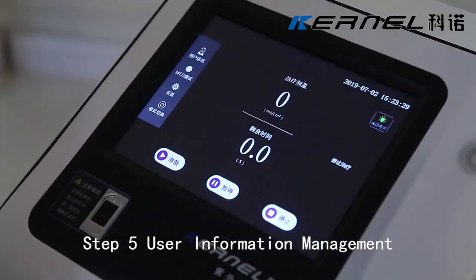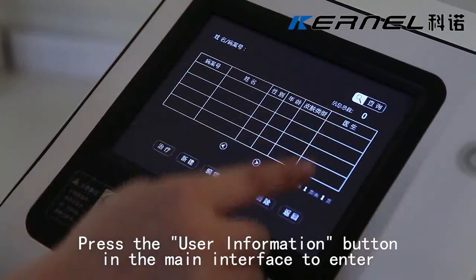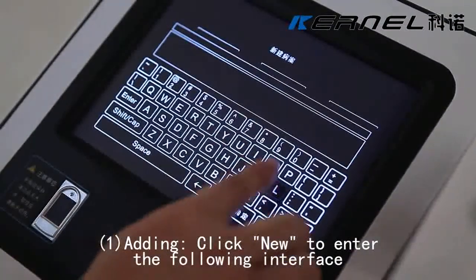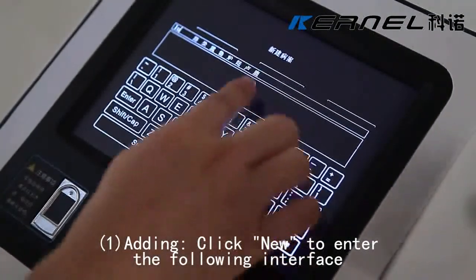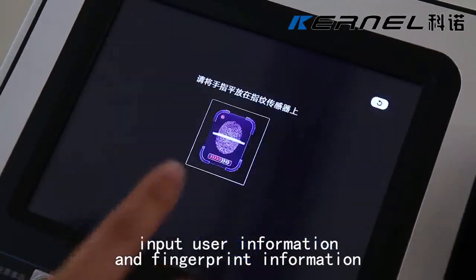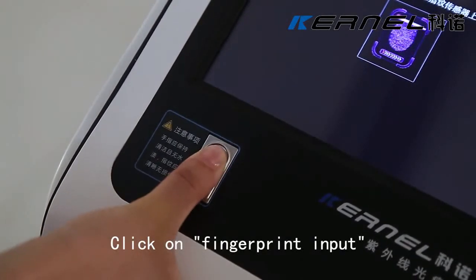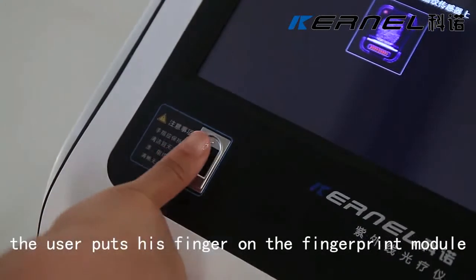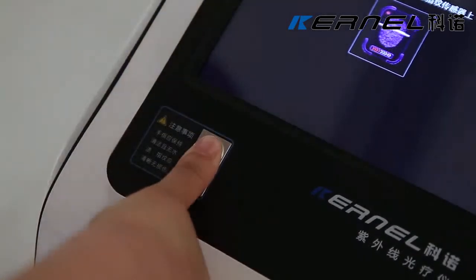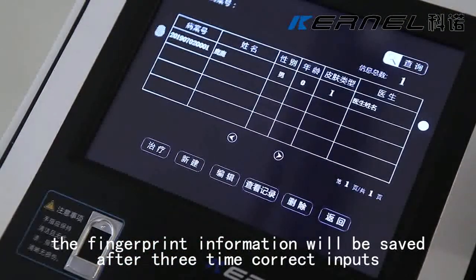Step 5: User Information Management. Press the user information button in the main interface to enter. Adding a user: click New to enter the following interface. Input user information and fingerprint information, then click OK to save. Click on fingerprint input; the user puts their finger on the fingerprint module. According to the prompt, fingerprint information will be saved after 3 correct inputs.